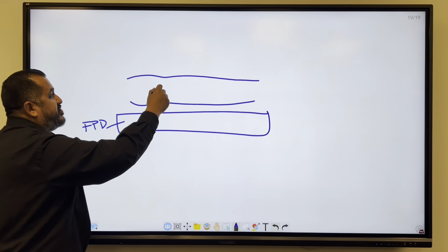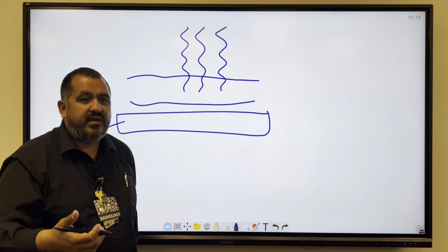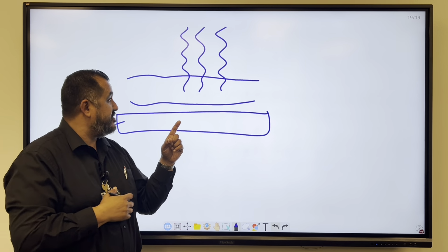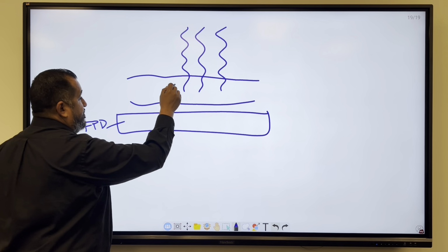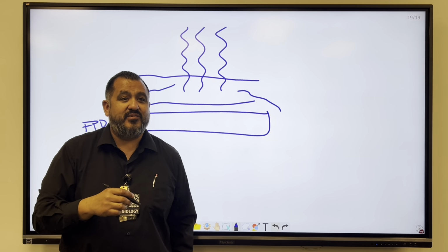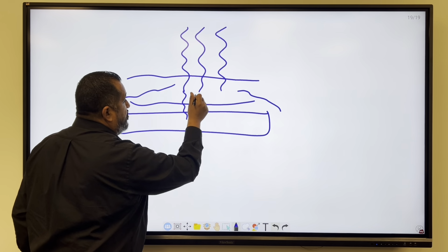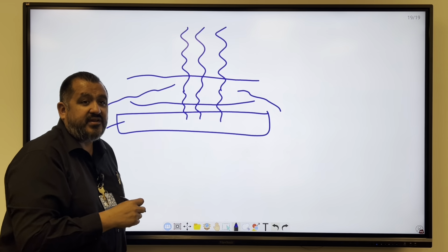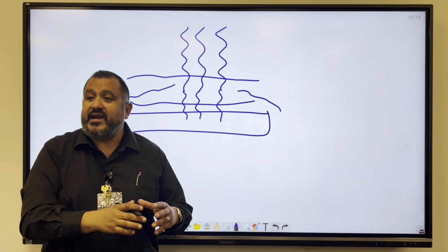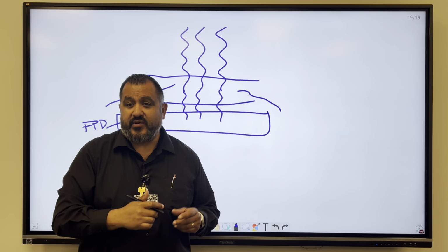Now, when you make the exposure, x-rays are going to go through, correct? This is just a quick rundown again. X-rays are going to either be absorbed through the photoelectric effect, or they're going to scatter, right? What interaction with matter is responsible for scatter? You remember? Compton, that's right. So Compton is going to scatter, or the x-rays can go through. We call that exit or remnant radiation. So that's your image forming radiation. If you ever get asked what your image forming radiation is, it's going to be your exit radiation, correct?